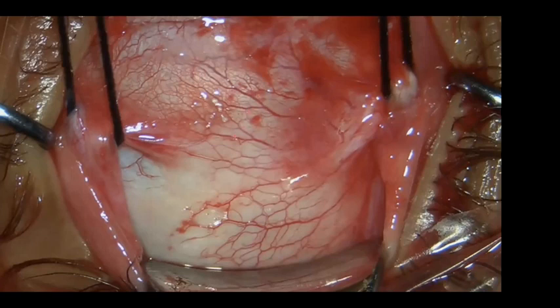Sometimes when the orbit is tight and the exposure is difficult, you can use a superior rectus traction suture. This will facilitate the exposure. The most important item while putting an implant is a good exposure. You cannot place the implant in an area where there's a lot of fibrous tissue or where the implant is not resting easily. The implant will migrate anteriorly.